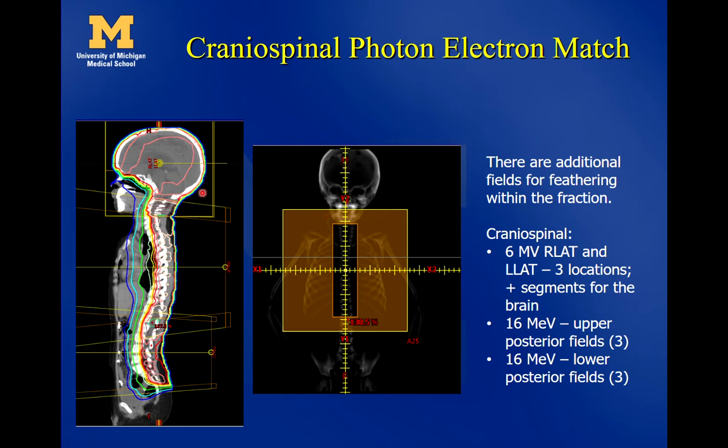So in this treatment, it's a pretty typical cranial spinal. You have this whole brain field treating maybe 6 MV x-rays laterally. Unlike a whole brain field, this one's coming kind of low, right? It's coming low down on the neck because you have these two electron beams. So here's electron beam number 1 and electron beam number 2. And these two electron beams are attempting to match as perfectly as they can inside the patient's body. We're also trying to match this electron beam, which is coming PA, with two X-ray fields which are coming laterally. That's very difficult to match up.